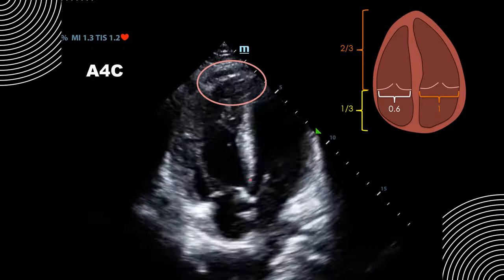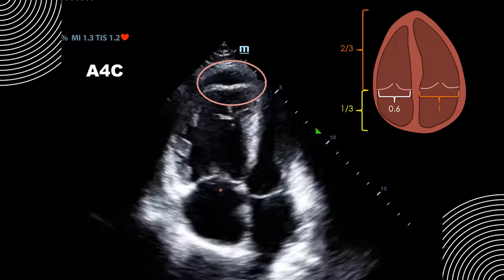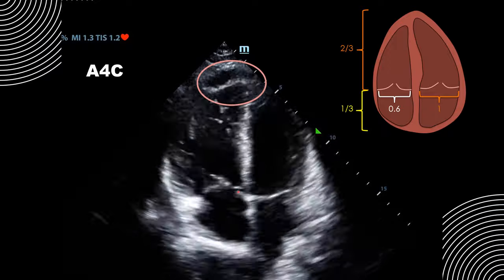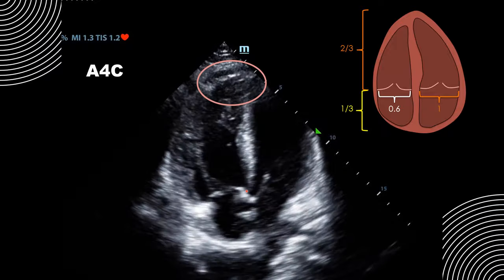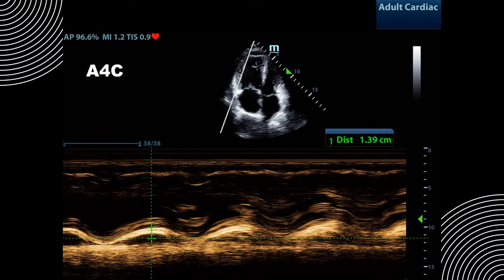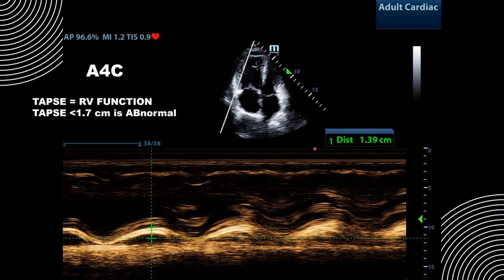The other finding is right ventricular dilation. Normally the right ventricle is smaller than the left ventricle, but in this view the RV is actually larger than the LV as measured at the annulus. Using M-mode placed through the tricuspid annulus, we measure the TAPSE — the excursion from the height to the trough. It has only moved 1.4 centimeters, which is abnormal and indicates poor RV function, representing the second half of McConnell sign.